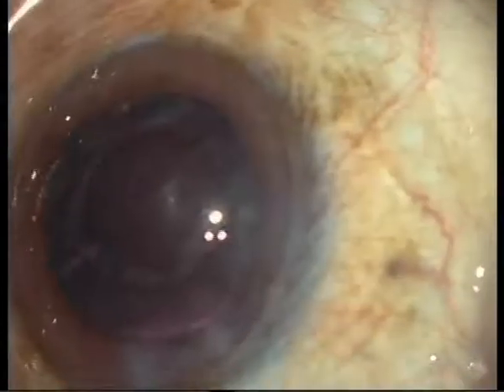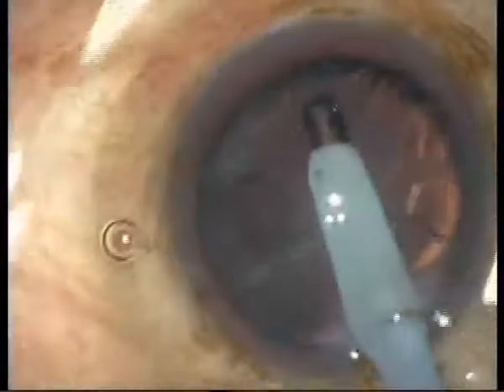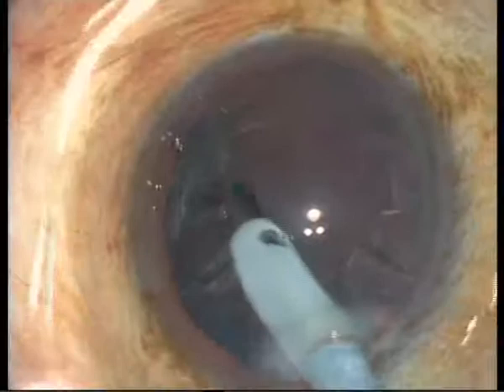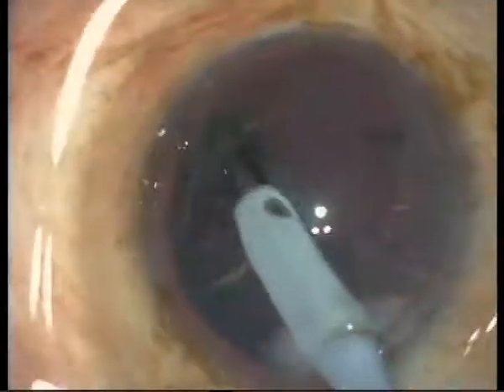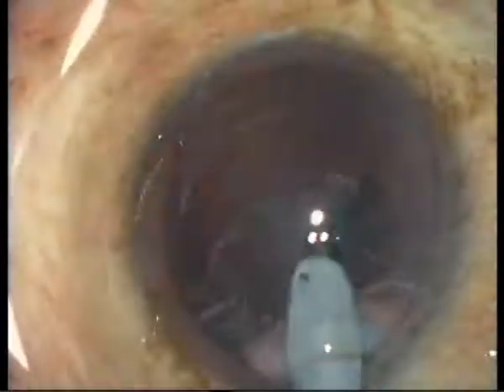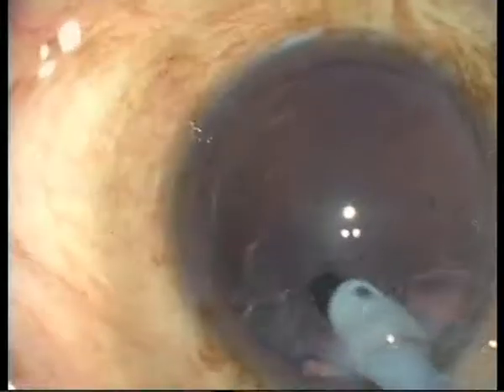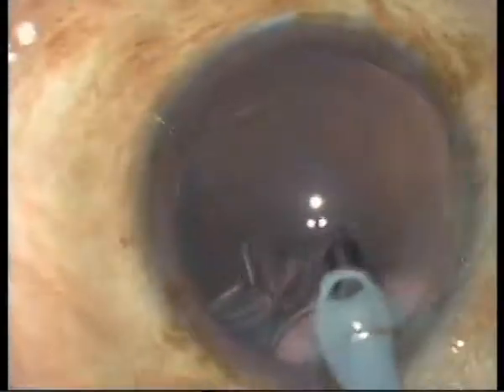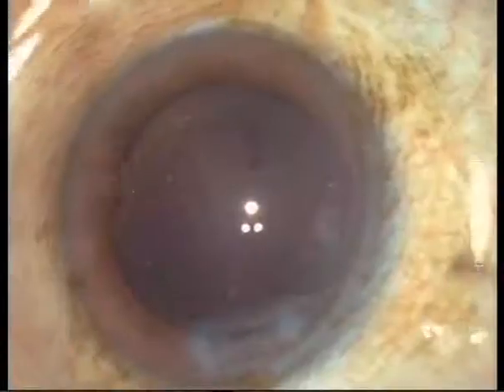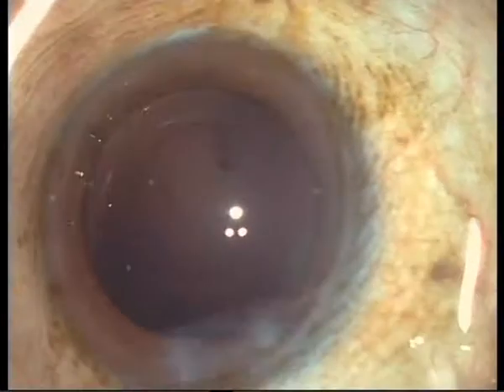Look in the light of the microscope. Linear. Then irrigation aspiration. This is all not very new of course, but I will also try to do afterwards a posterior capsulorhexis. And the posterior capsulorhexis, I always do that under topical anesthesia.